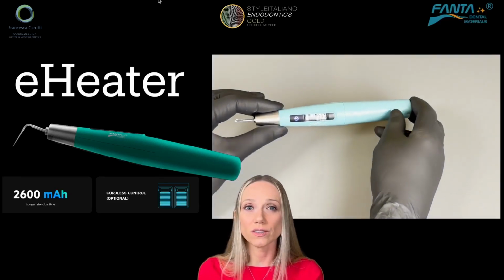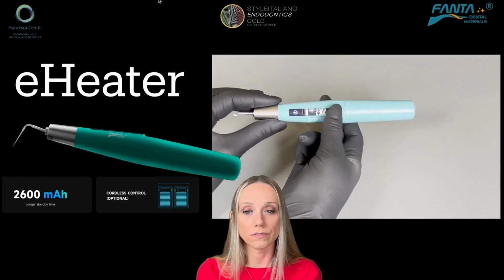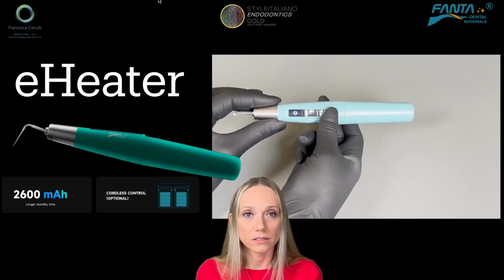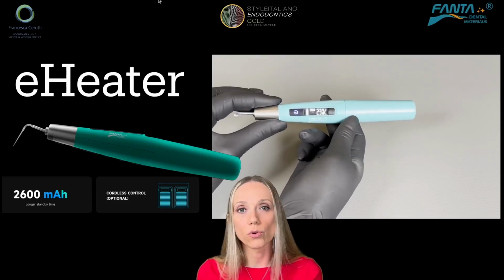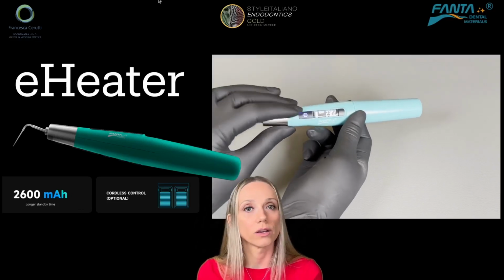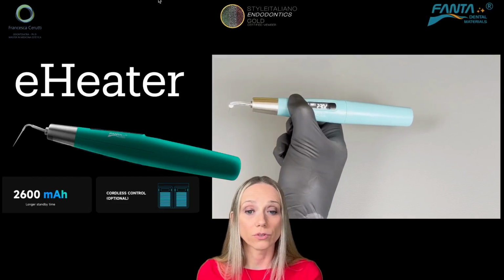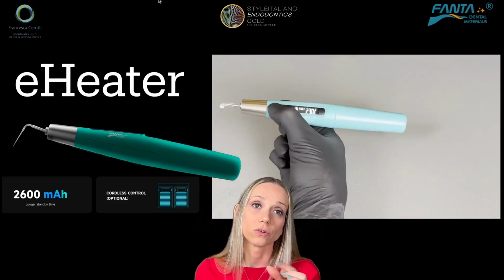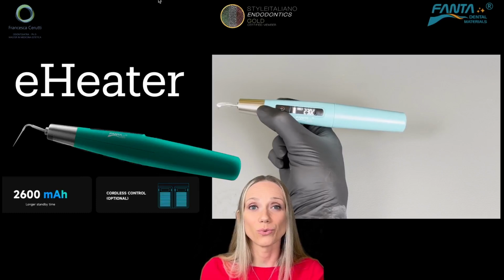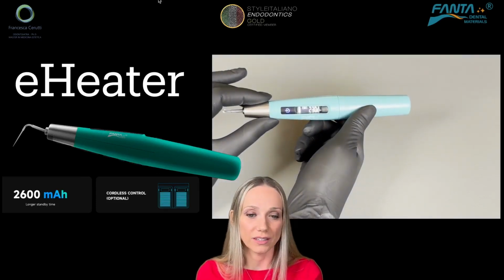You see that in the video I changed the tip and then I turn on the device again, I select the temperature that I want, so 110, 140, 170, 200, 230, and then I just have to press the button on the left to start the device. And when I start the device, the light turns on, and so it helps, if you use a microscope, to see what you are doing exactly.